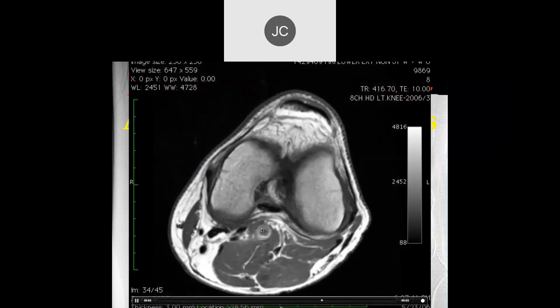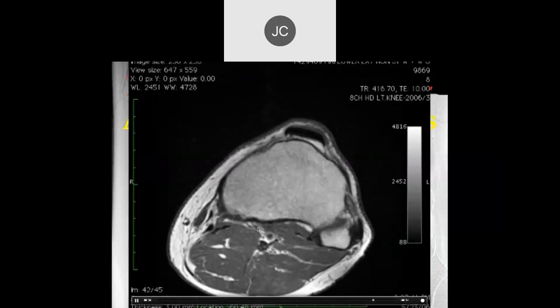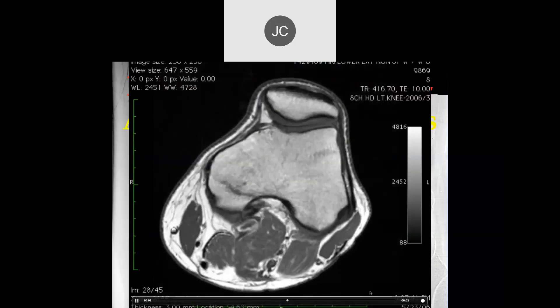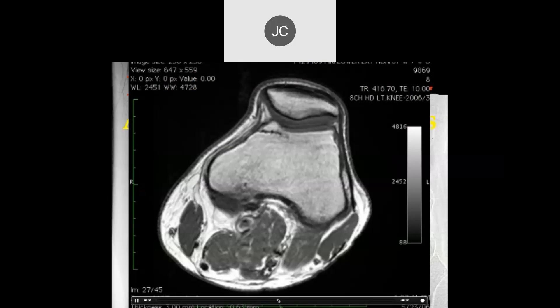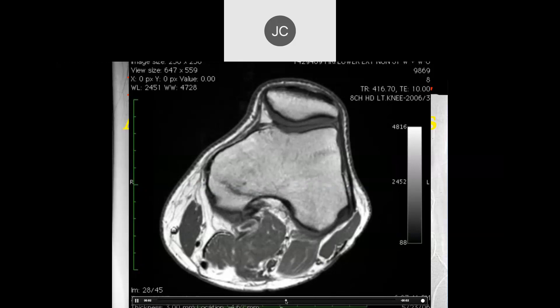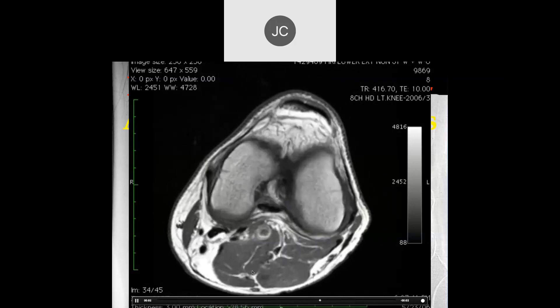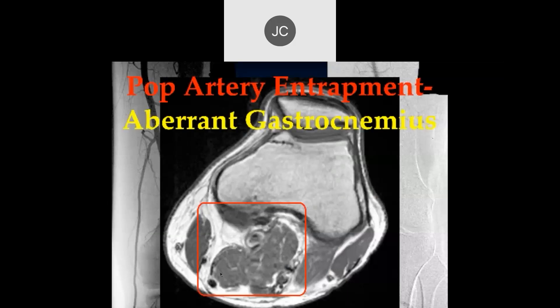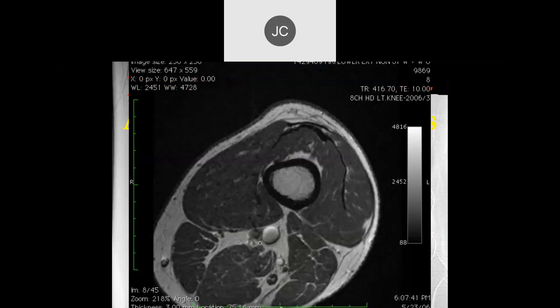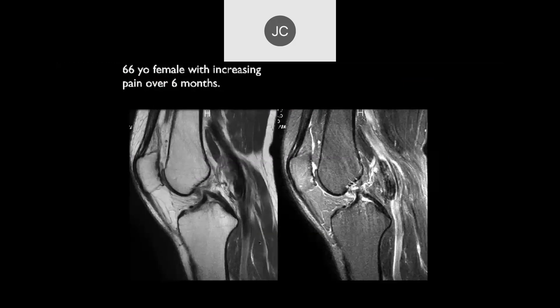In the video, notice the artery getting pinched right there — it's coming down and getting pinched between an abnormal gastrocnemius muscle variant in the midline and the posterior medial femoral epicondyle. The artery is being compressed by this abnormal variant muscle. This is called popliteal artery entrapment.